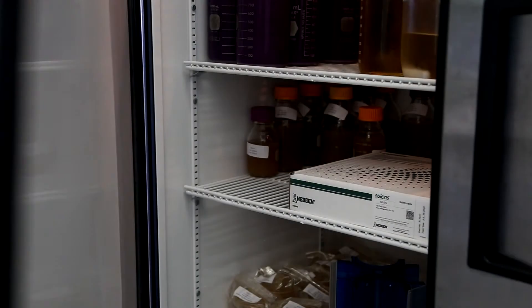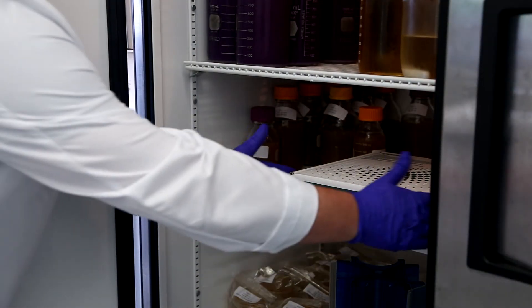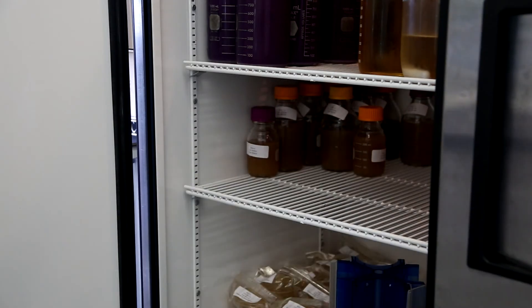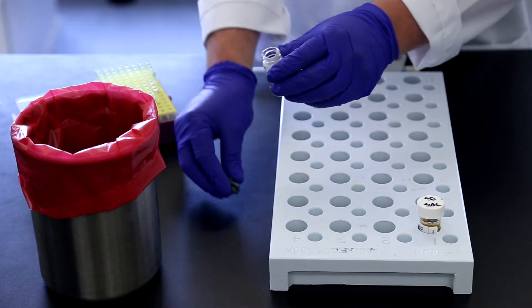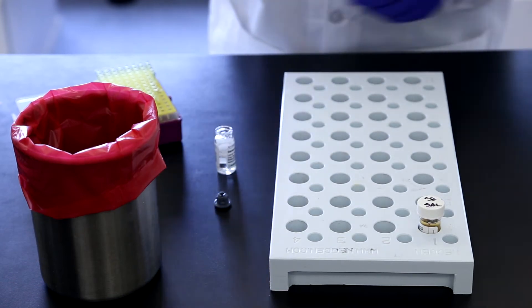For Salmonella, remove S2SAL vials from the refrigerator and allow to come to room temperature, about 30 minutes. Place vials being tested into the vial rack and supplement as necessary.